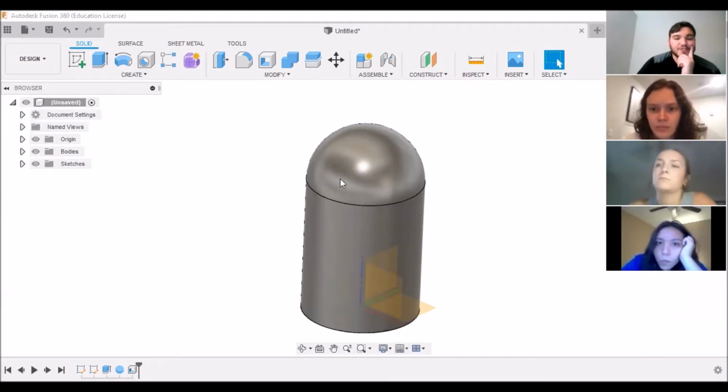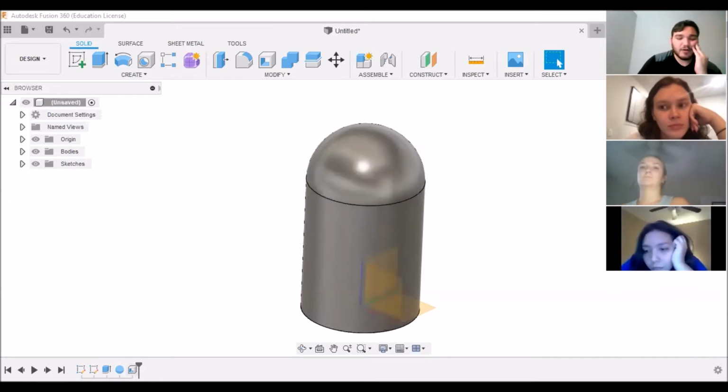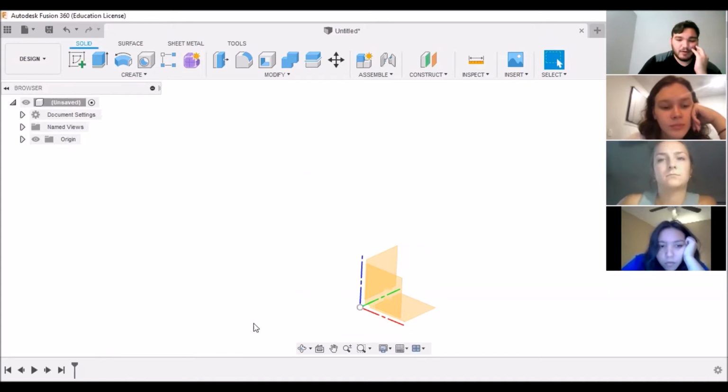The biggest issue that we have right now is, does this look like an actual fingertip? Not really. So there are other things that we can choose to do to make it a little bit more organic. This is what I most prefer in designing a lot of this stuff. So for instance, like we were saying earlier, we can go down to the bottom, drag everything in our timeline back to the beginning, right click and delete all features after history mark. And it's basically like you started over.